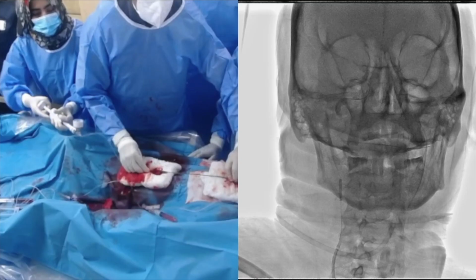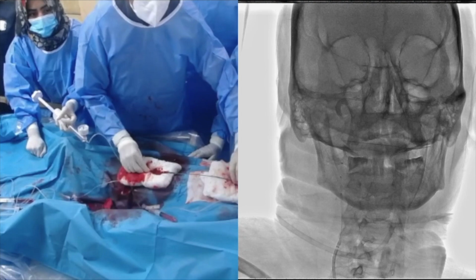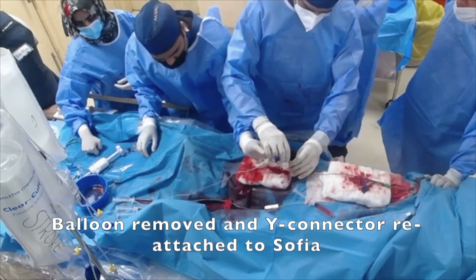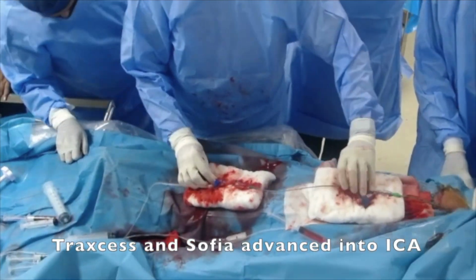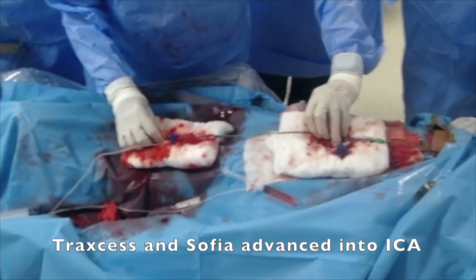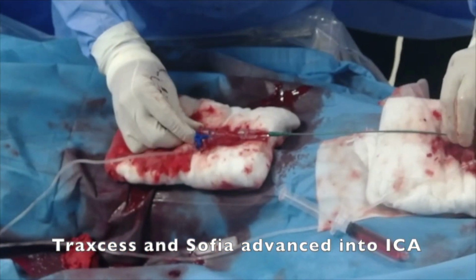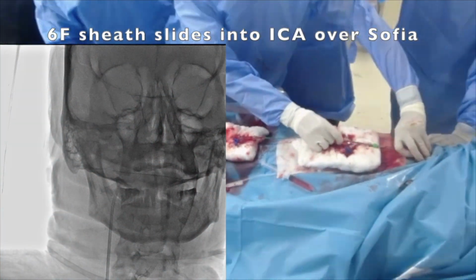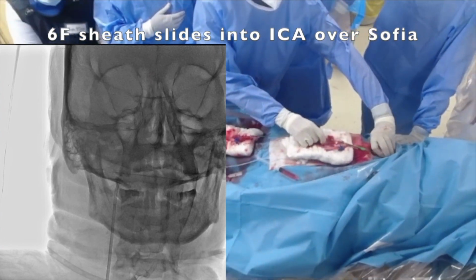I decided to deal with MCA first, and over the deflating balloon I pushed Sophia Plus into the ICA and then advanced my wire, advanced Sophia deep into the internal carotid artery, and on top of this Sophia I was able to push my 6 French destination sheath into the internal carotid artery and park it distally so that I don't lose my carotid access again.